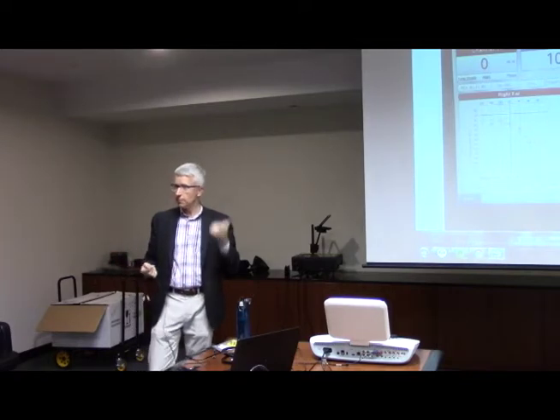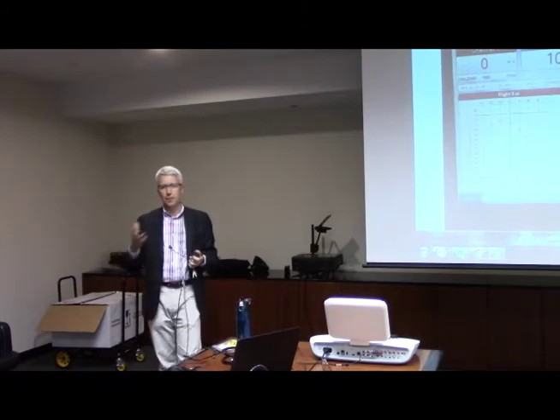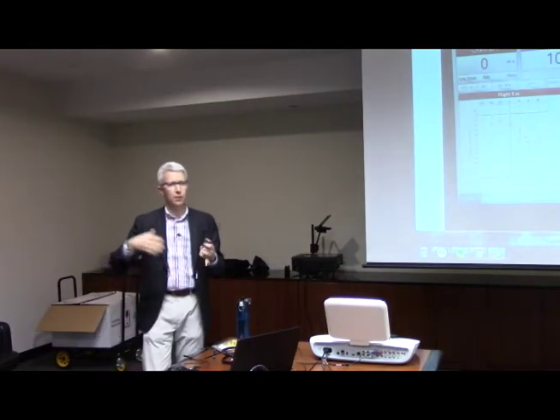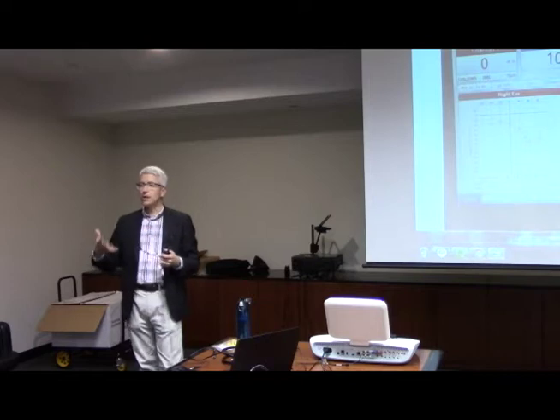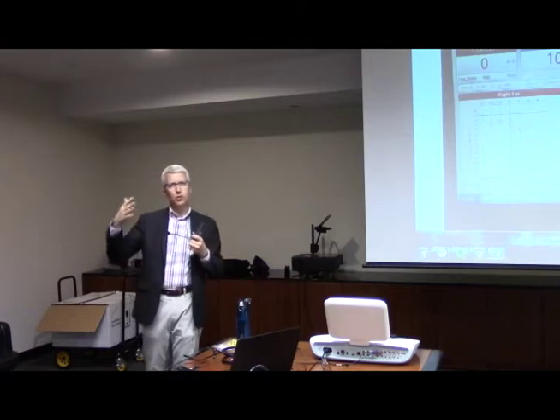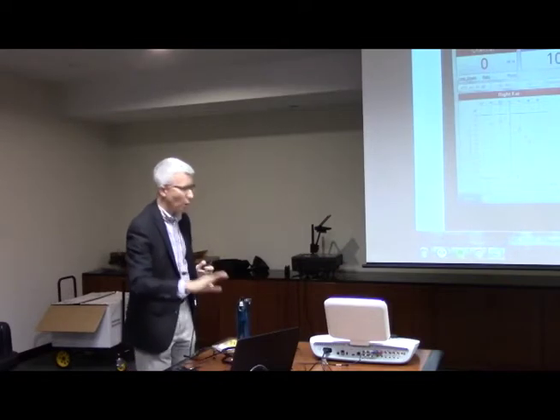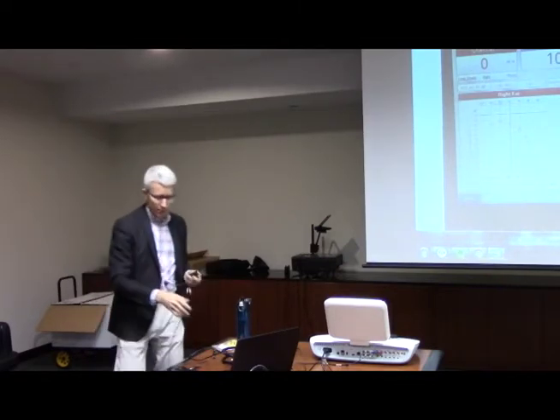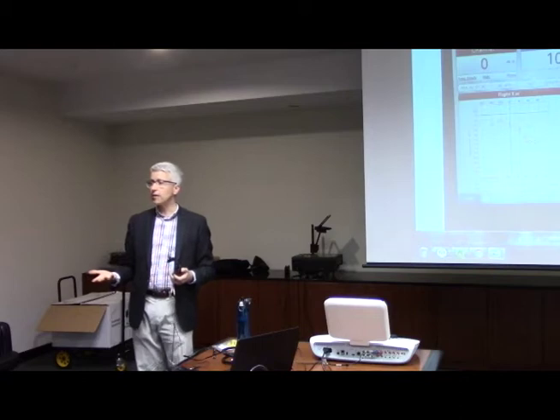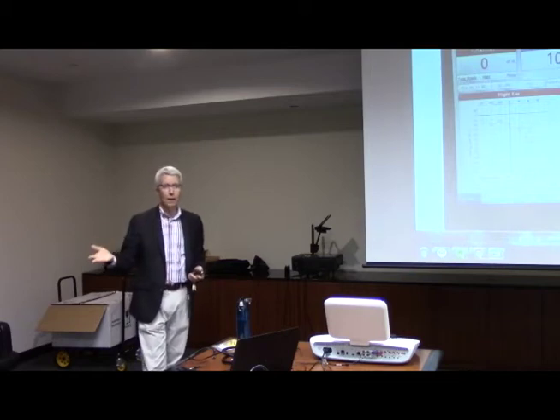So this is a mic monitor headset that allows me or whoever's doing the testing to both talk to the patient, hear what's going on, but also to present words as part of the hearing test too. So anybody who's had their hearing test is familiar with the tester saying, say the word baseball, say the word cowboy, say the word hot dog. And by doing this, we're looking for how well the person can understand, and also how softly they can understand speech. And so we go through quite a bit with this. Again, it's presented through the inserts or through the headphones, just to find out how well they can understand speech. So we give them a list of 25 or 50 words and score that basically. So we end up with a score.